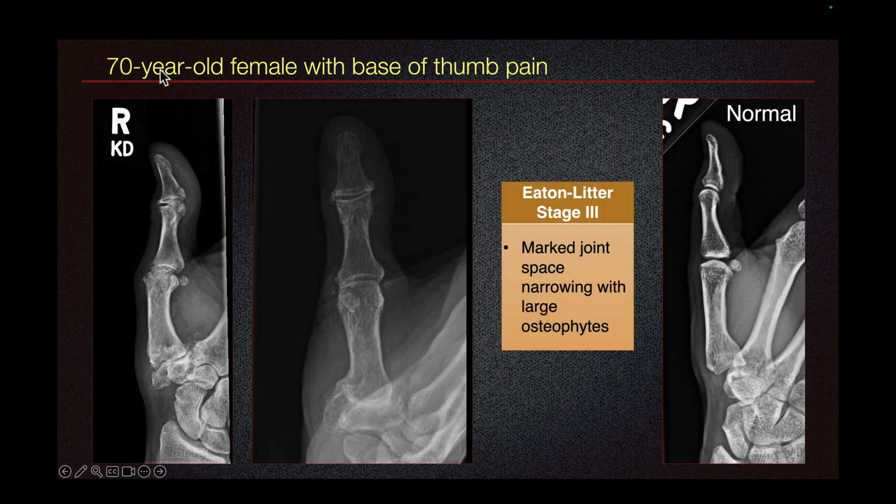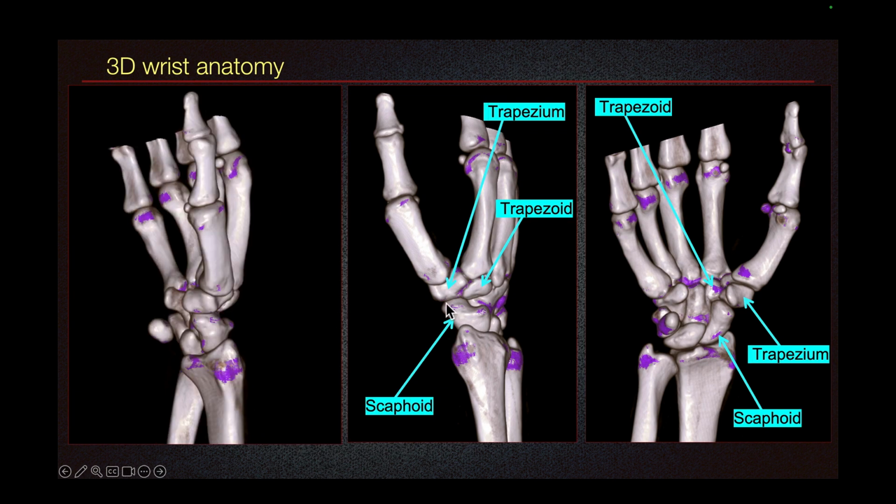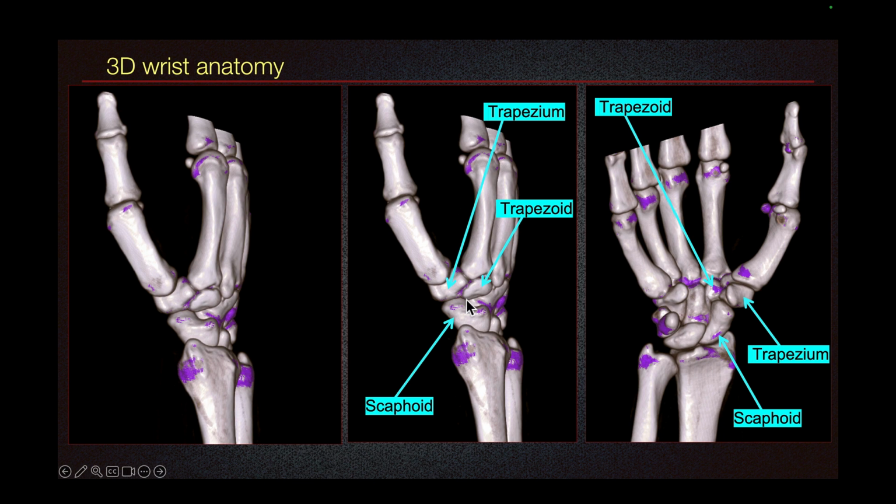We have a case of a 70-year-old female with base of thumb pain. Here we see severe joint space narrowing. So this is stage 3 osteoarthritis, and we have normal on the right for comparison. In stage 4, in addition to the first carpometacarpal joint arthritis, there is also arthritis of the scaphotrapezial joint. And this is the scaphotrapezial joint one more time.